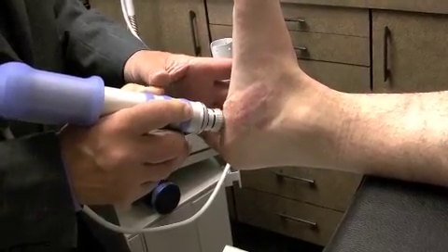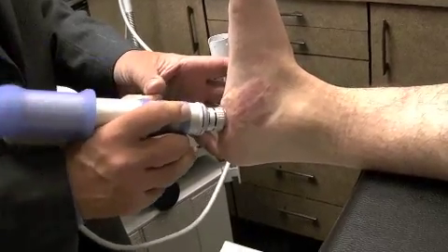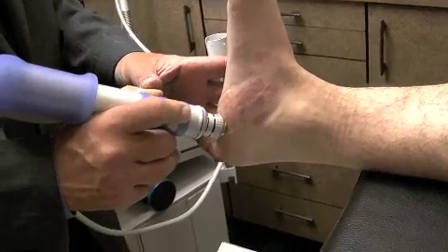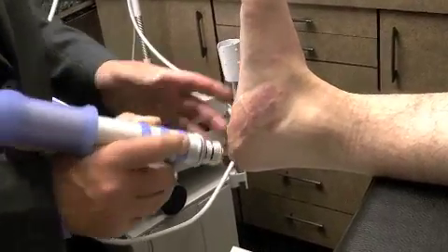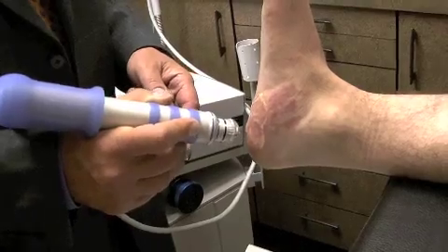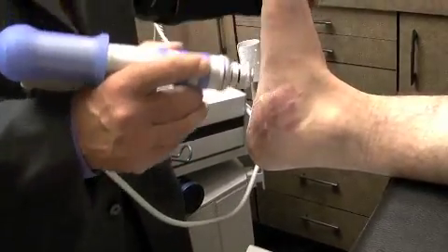And when you find the area that's the most intense pain, try to stay right in that spot and just rock it up and down when you're in that spot. We're going to go around that area, finding it like that, about the size of a silver dollar, so that you get it all. One good thing to do is have your athlete take a little marker or a ballpoint pen, mark the area that hurts him the most after he stands up, and then you have an idea of where to go. So for the plantar fascia, that's how we would do it, or for any other areas.